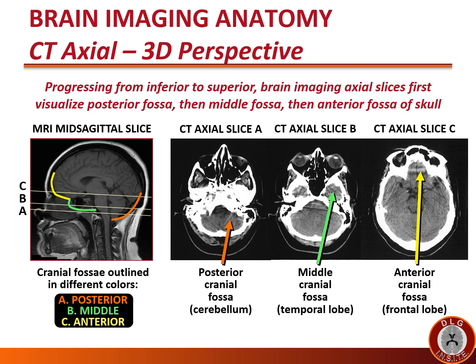The next slice up, the axial slices go through the middle cranial fossa, outlined in green and shown with the green arrow on slice B. Then higher up, the axial slice shows the anterior cranial fossa where the frontal lobe sits, outlined in yellow with a yellow arrow. So as you go from the bottom to the top on axial images, you'll see the brainstem in the posterior fossa, the temporal lobes in the middle cranial fossa, and then the frontal lobes in the anterior cranial fossa.